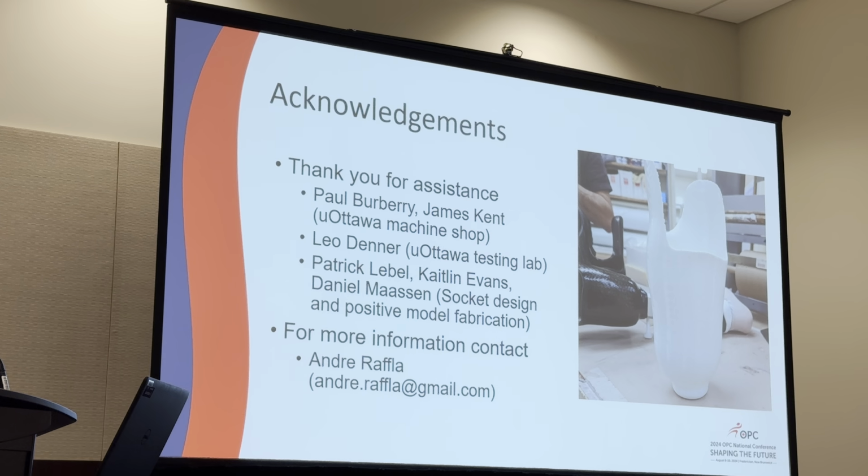Are you able to scan the inside of an existing socket? No, so what we're doing is that we're taking the existing scan from the outside for now.